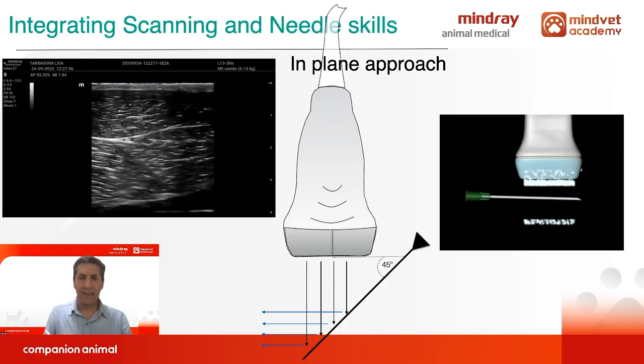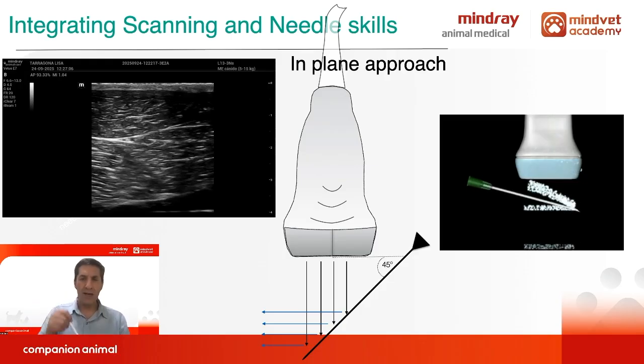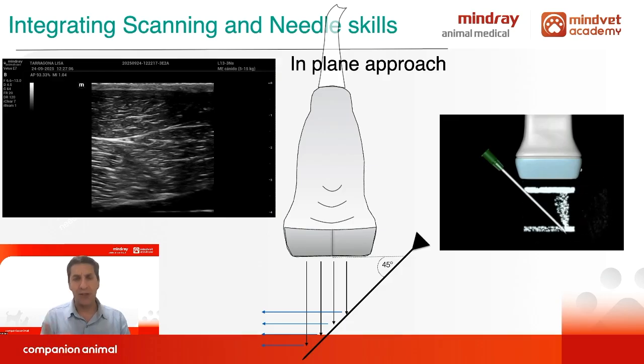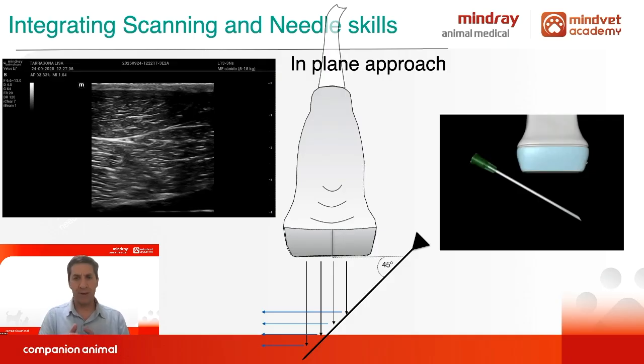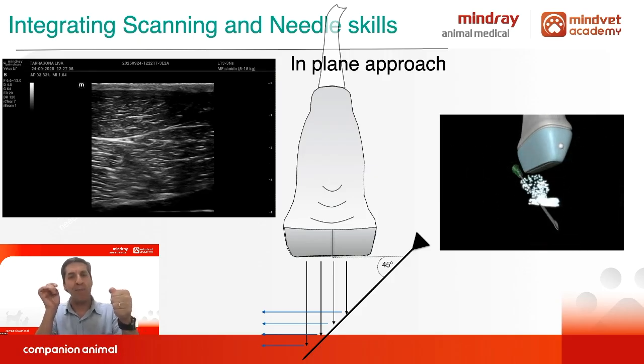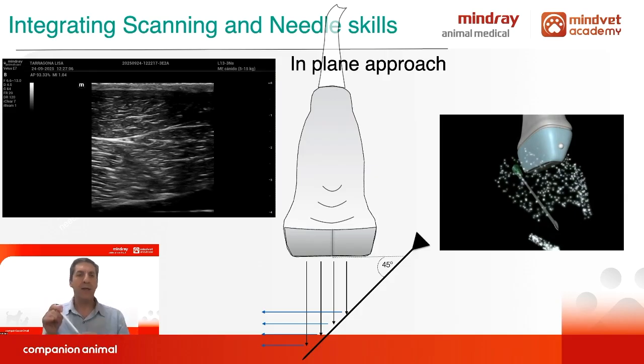Remember, as the angle you use increases, the needle will be trickier to identify or visualize on the screen. So try to organize your setting in order to reach the proper angle. That means the angle that allows you to visualize the needle correctly.